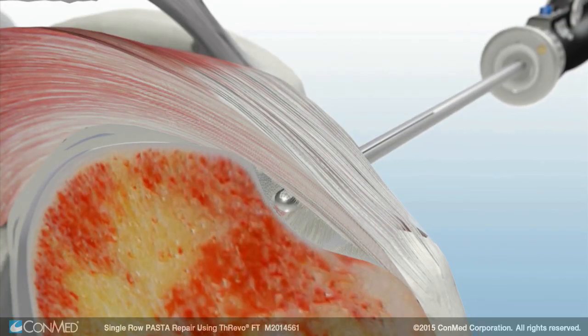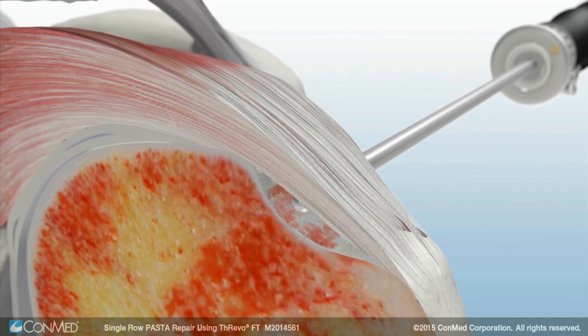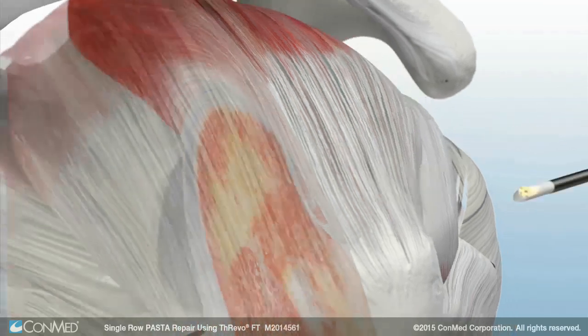From the articular side, the Ultra FRR dual-purpose shaver blade is used to debride the edge of the tear and abrade the bone to remove soft tissue from the footprint. The edge bipolar RF probe is used to debride the bursa.